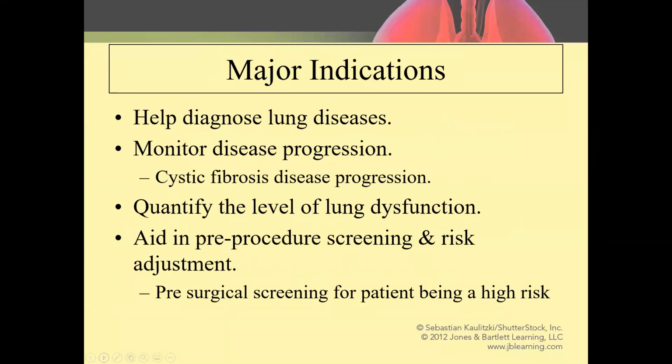So the major indications: broadly speaking, pulmonary function testing is done to help diagnose lung diseases. No surprise there. In some cases, it may be very useful in distinguishing between the 2 main categories of COPD, or chronic obstructive pulmonary disease. A disease such as emphysema is an obstructive disease, as is chronic bronchitis.